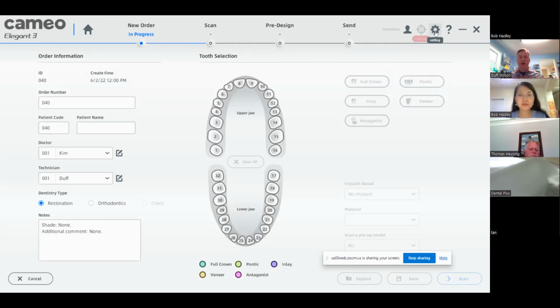But once an office gets familiar enough with how we do our contacts with them, we do specific contacts, specific occlusal clearances for every doctor, and we dial it in for the doctor. And once he's comfortable or she's comfortable, we give them an option on the very simple cases to not do a model. But any doctor that we start with, they're going to get a model to start with.